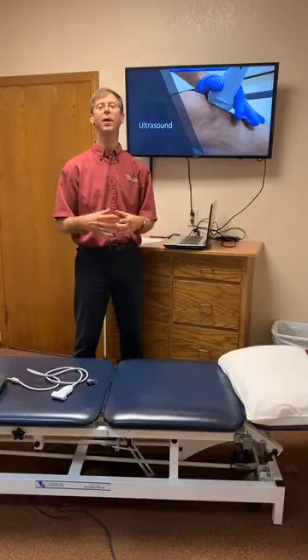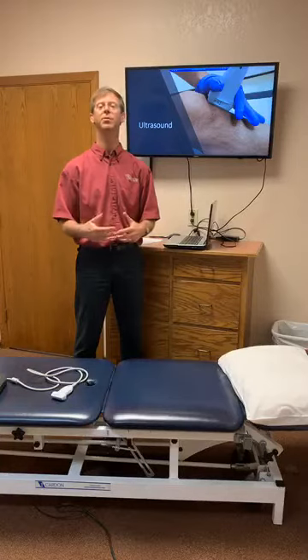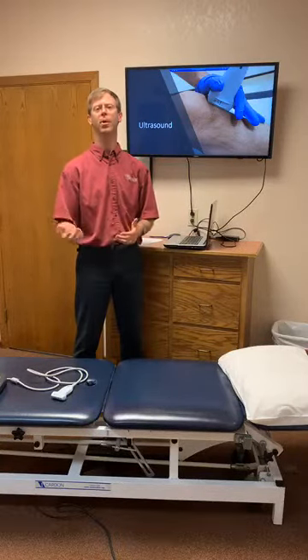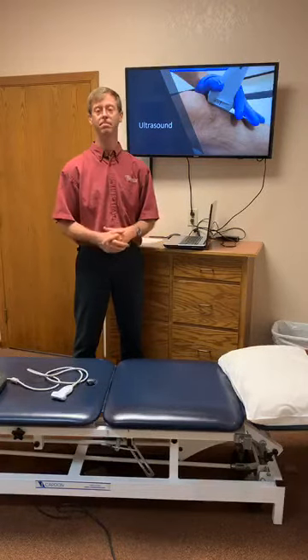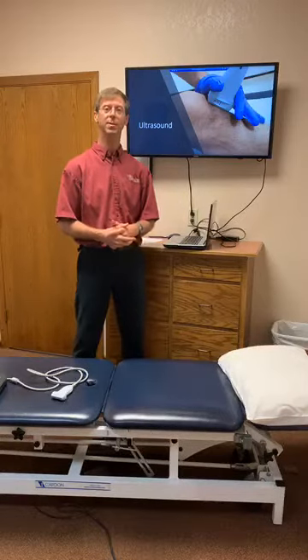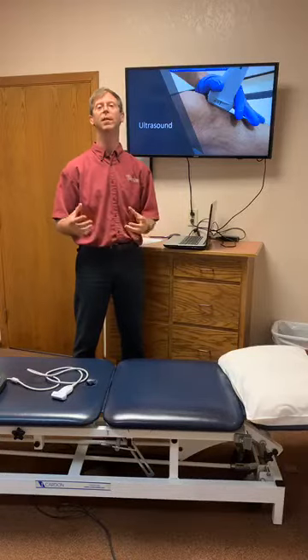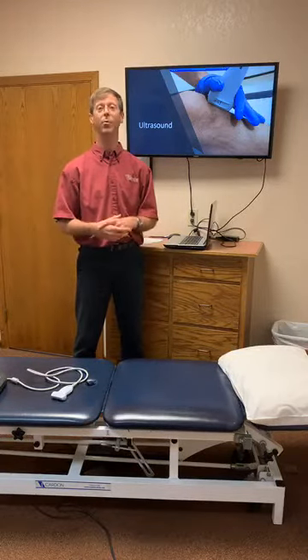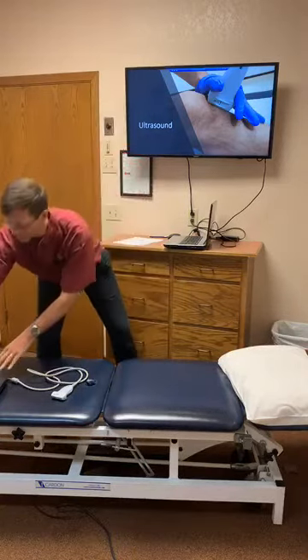So it helps to increase tissue temperature, it increases the blood flow, so we can use that to help facilitate healing on maybe a sprain or a strain, or a bursitis perhaps even. Now, diagnostic musculoskeletal ultrasound is a little bit different in that that is actually used to help evaluate, in this instance, the knee. And we're going to do a demonstration right now on that. Let me turn this on.